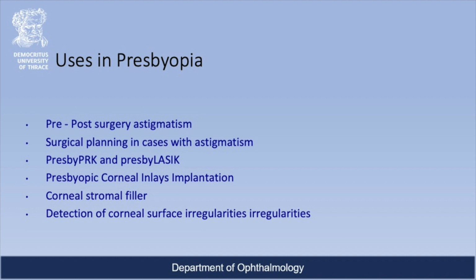The uses of Placido disc topographers in presbyopia include the following. First, planning and follow-up of presbyPRK and presbyLASIK. Second, assessing longitudinal refractive, keratometric, and topographic changes following presbyopic corneal inlay implantation. And third, planning and evaluating the feasibility of corneal stromal filler injection to create bifocality to correct presbyopia.